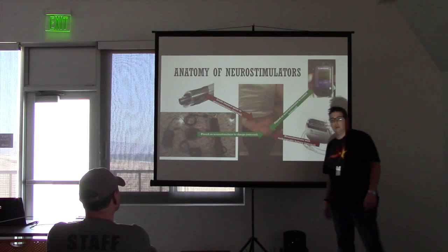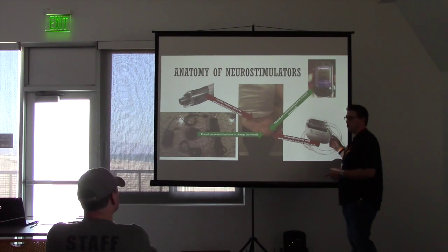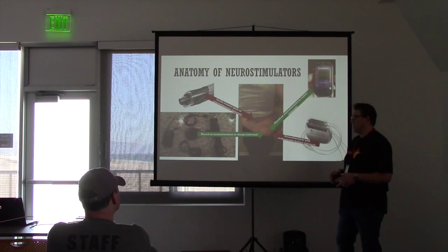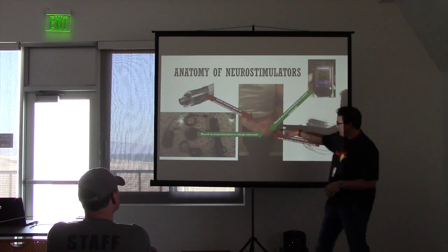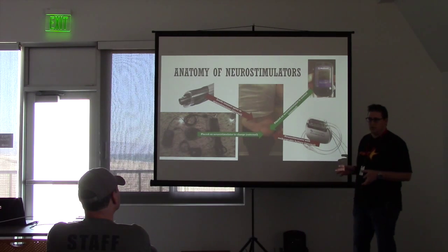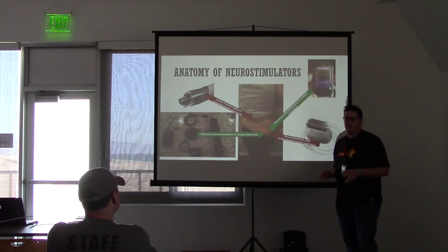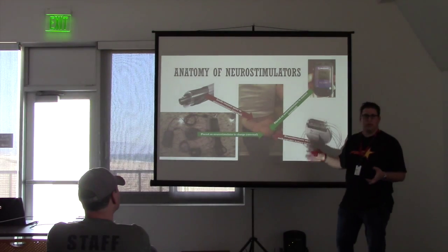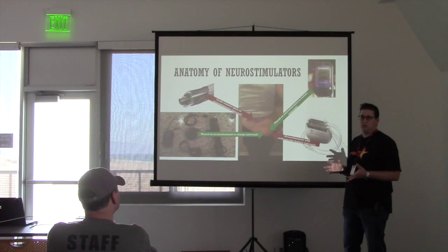So when I said small wonder, it wasn't a joke. She literally has to charge herself every week, or else the battery in this device will die. Depending on how much she's using the stimulation, it's either a week or 2 weeks, but she has to lay there and actually charge for multiple hours at a time. Depending on the signal strength of this unit here, which will show bars, if she gets 2 bars out of the 8, it takes 12 hours to charge. And just imagine sitting there, you can't fall asleep because it's dangerous. You actually have to sit there while you're charging. If I get full bars on it for her, it only takes 2 hours to charge. But you're literally heating your back at that point as you're doing magnetic charge to the skin.